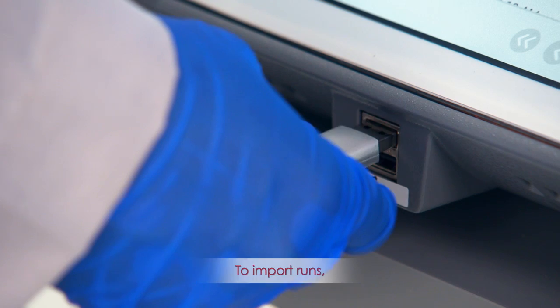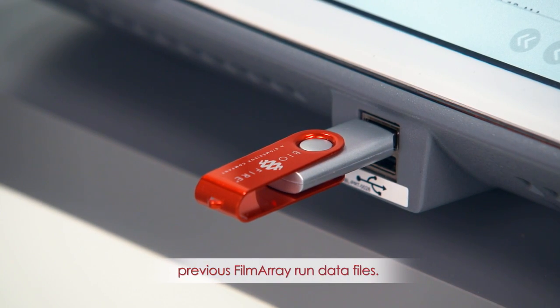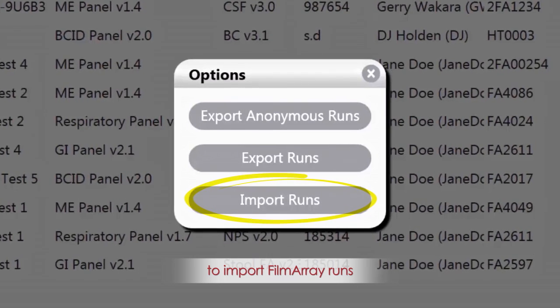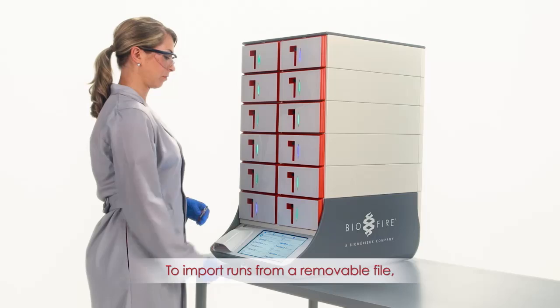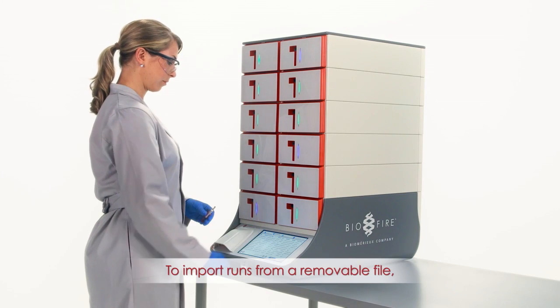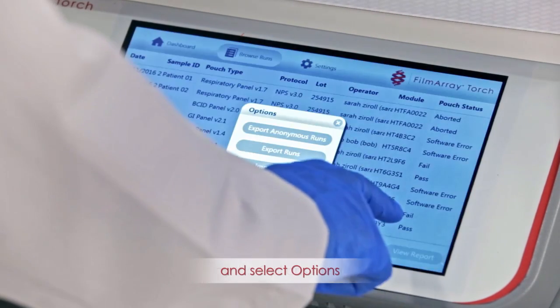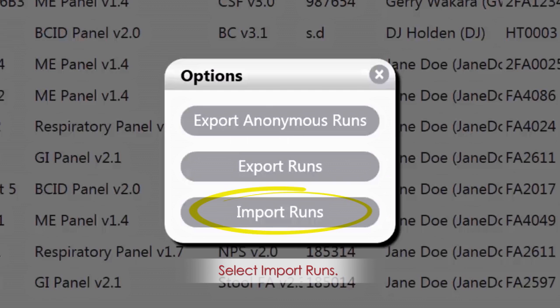Import runs. To import runs, connect a removable drive containing previous FilmArray run data files. The Import Runs feature enables you to import FilmArray runs into the Torch base. To import runs from a removable file, navigate to the Browse Runs tab and select Options to display the Options menu page. Select Import Runs.